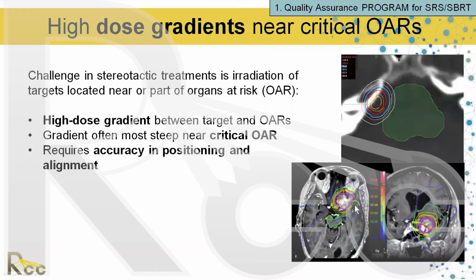These are common things in an intracranial program that you're going to experience. We also know that we want to irradiate as little of the brain as possible, because there are other issues, like if you're near the motor strip. So getting it right and getting it in the right spot is really critical.